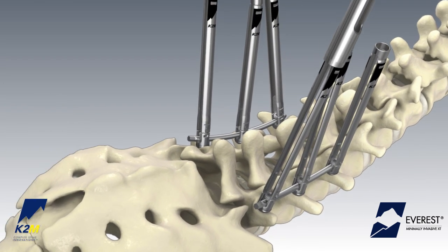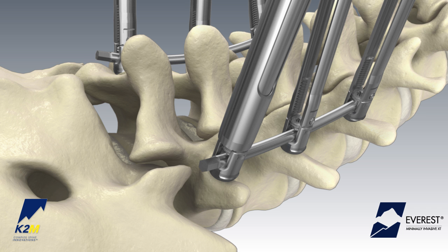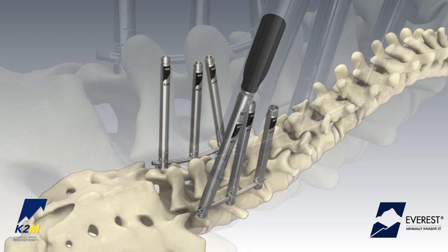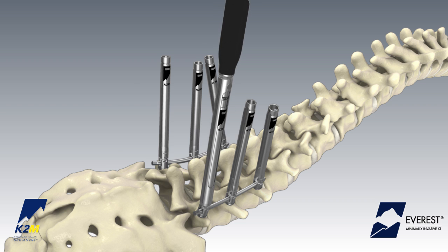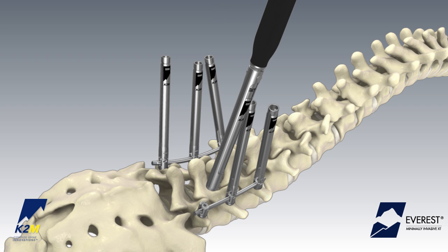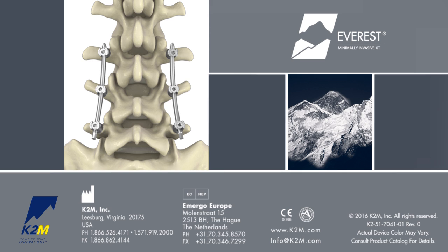Slide the removal tool over the XT screw until the distal tip of the instrument is flush with the top of the screw head. Break the tab off aggressively by rocking the instrument back and forth until the entire tab is fully detached from the screw head. The Everest MIXT Spinal System from K2M. Complex Spine Innovations.